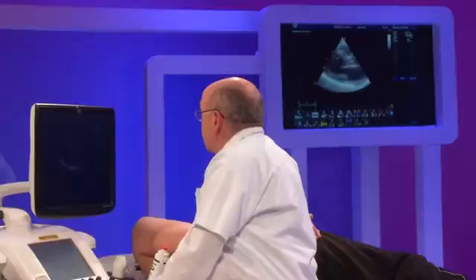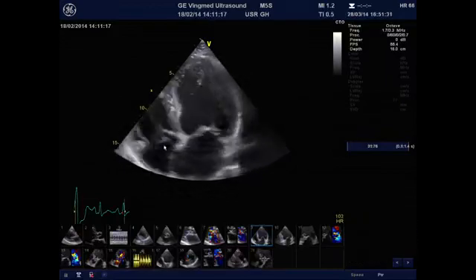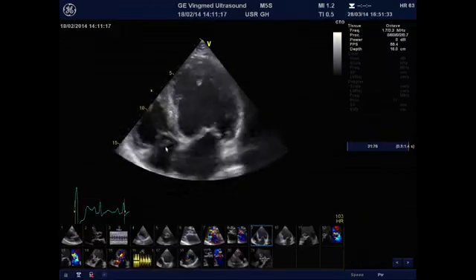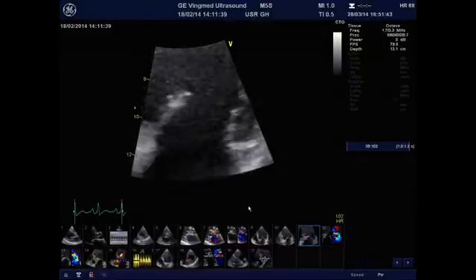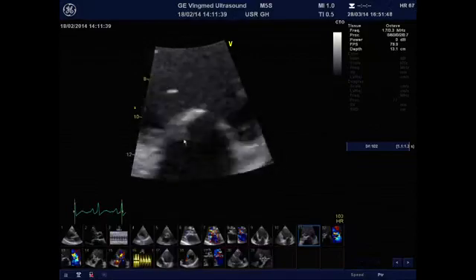Now, the first step, and it is very important: when we have an endocarditis on one valve, we need to go to the other valves. We already saw that this patient also presented with a tricuspid lesion, probably a tricuspid vegetation, but we also need to look particularly for the presence of mitral lesions. And if we look in more detail at the anterior mitral valve, we can see that again there is something wrong here on the anterior mitral valve.